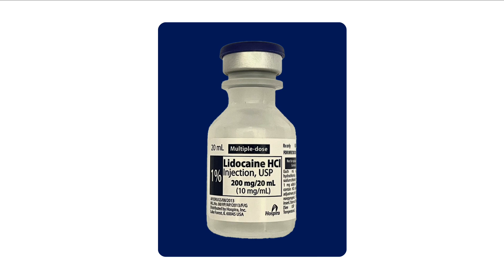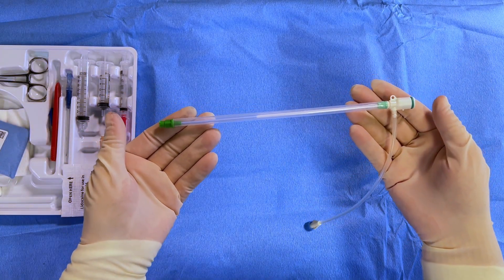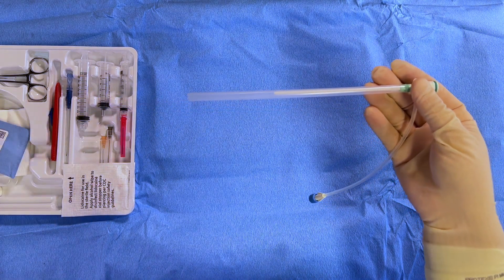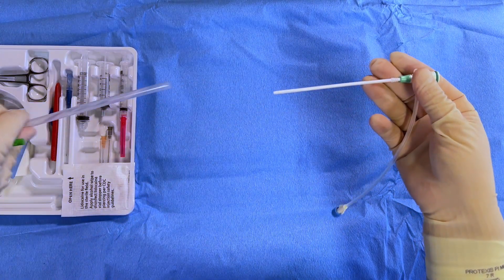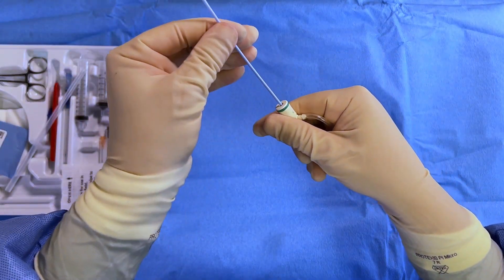While local anesthesia is being achieved, prepare the sheath and pacing materials. The dilator and the 6 French sheath come prepackaged in opposition. Withdraw the dilator and insert it into the hemostatic hub of the introducer until you feel a subtle click.